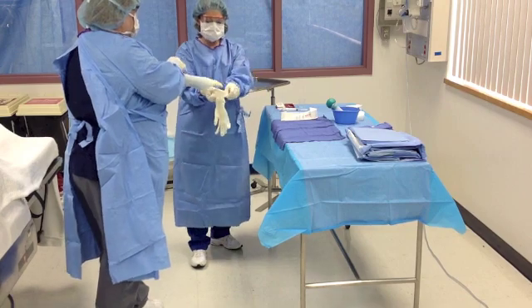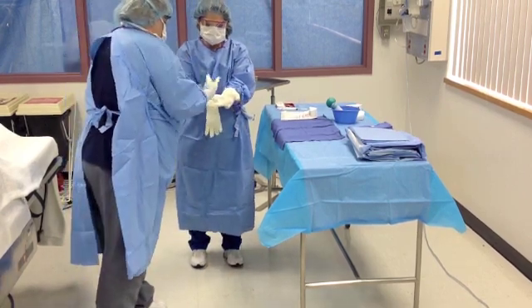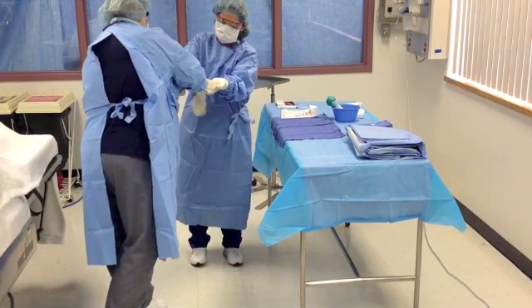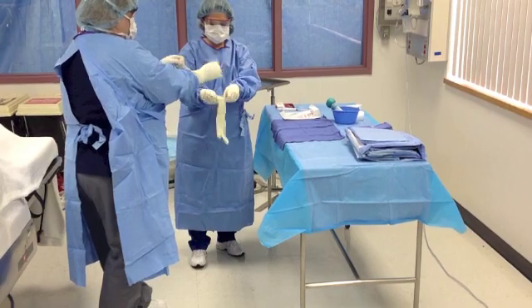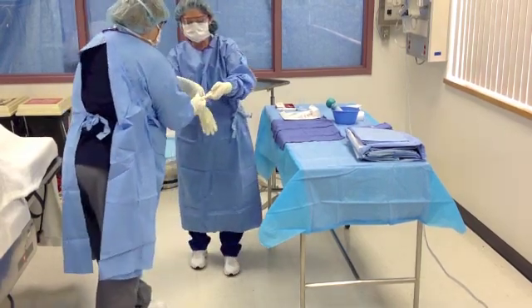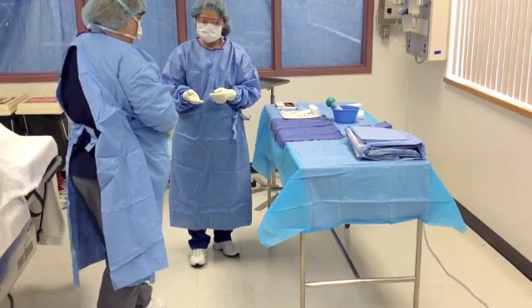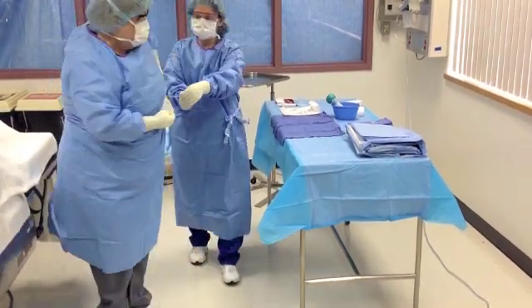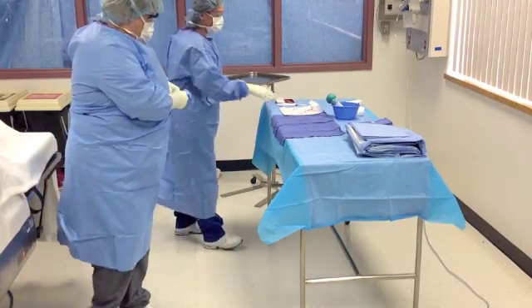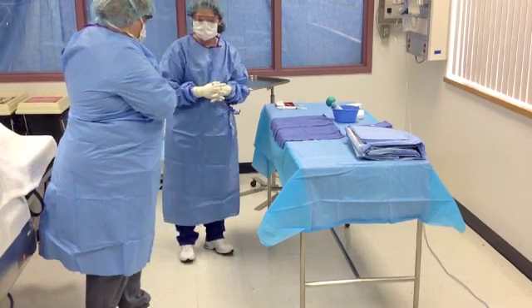Retrieve the second pair of gloves for double gloving and repeat the process once more. Assist the surgeon in turning the gown by grabbing the tip end of the tag that has been presented to you. Then, once the surgeon has turned, pull the tag off and discard it.